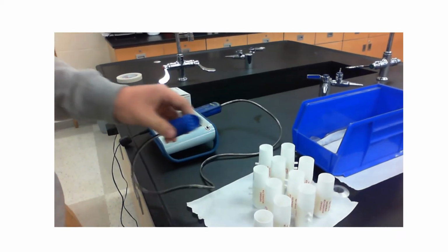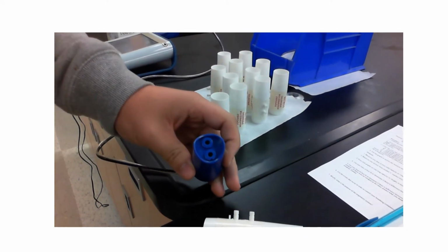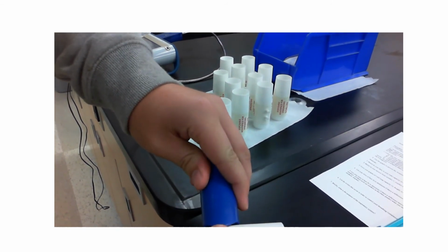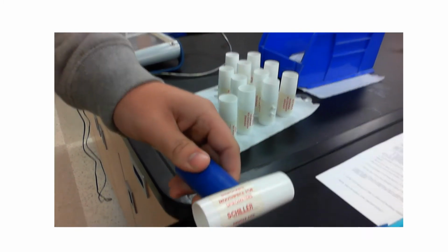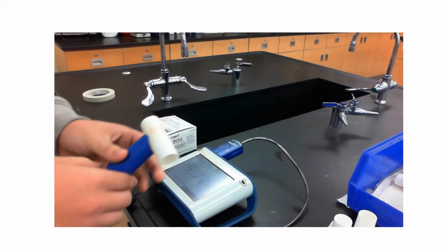So we've got to line up. There's a pin on the one end, and you have to make sure it lines up with the hole in the top of the blue adapter. So they just roll in together. Perfect. They should slide in with a little click. Perfect. There you go. Good. So the longer end is where your mouth goes, and so that's that piece.